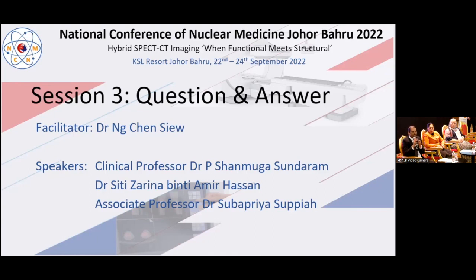But otherwise, I like to do a contrast enhanced CT in almost all patients because I have the confidence to report that. And more than my confidence, I strongly believe that after the SPECT-CT is done with me, I don't want that patient to go again for a regional CT. So I want to give as much information as possible. That's how I approach.